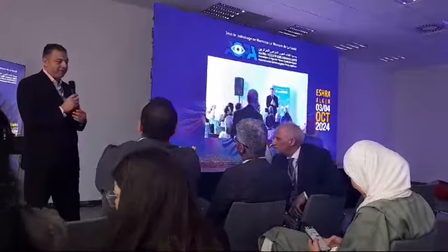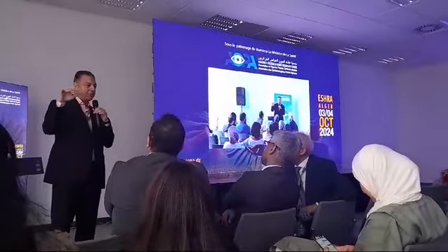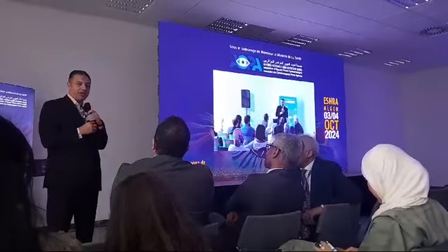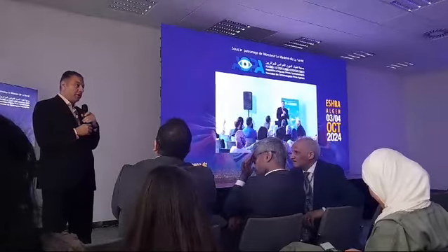Yes, 5 years ago I met Michael Belin in India, and I asked him this question: in your display, do you trust it with cases of post-LASIK ectasia? He said no. Actually, changes in the Pentacam, changes in the topography, changes in the pachymetry, and changes in the spatial profile of the corneal thickness curve can make it look suspicious while being false. So checking the back curvature and the back elevation is a clue for detection and diagnosis of post-LASIK ectasia.